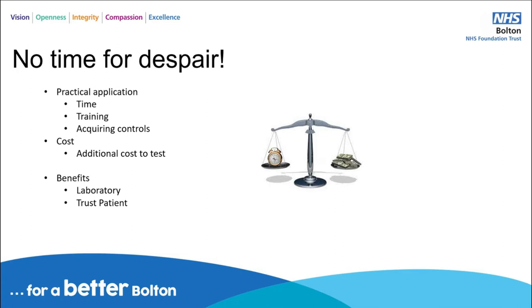From those points, and then secondly, in some instances acquiring control material isn't very easy. In many instances, I know we experienced where third-party controls, particularly for the molecular platforms, just weren't available. And where they were available, the cost associated with the control material was just phenomenal for very large quantities, where we would possibly think about using controls over a period of time. It wasn't going to be easy when we were thinking about the cost associated with new lot numbers, lot number variation, various aspects of it. The cost was just going to be accumulating.